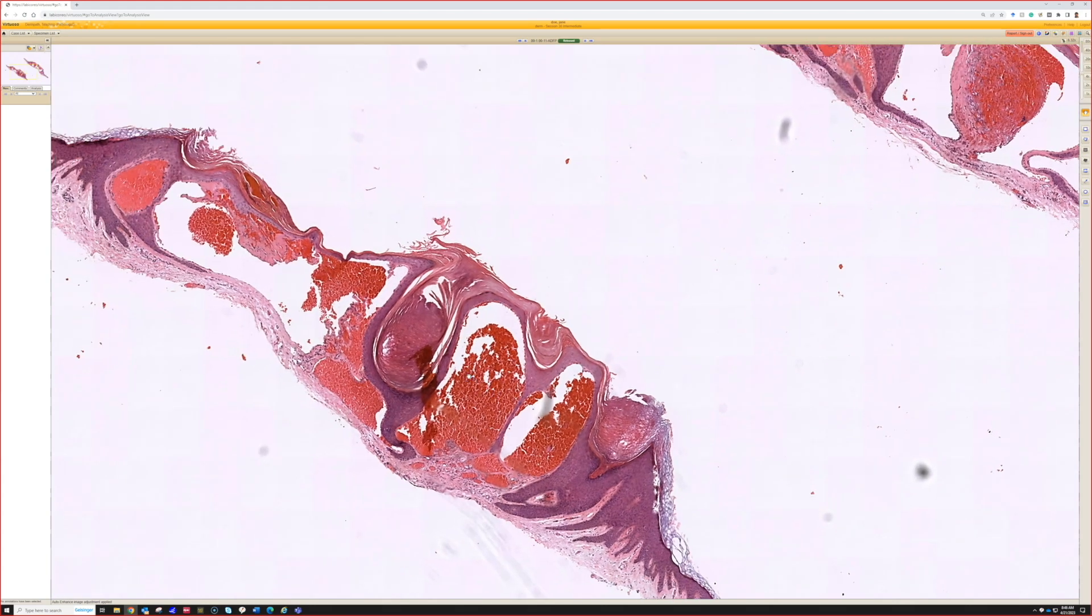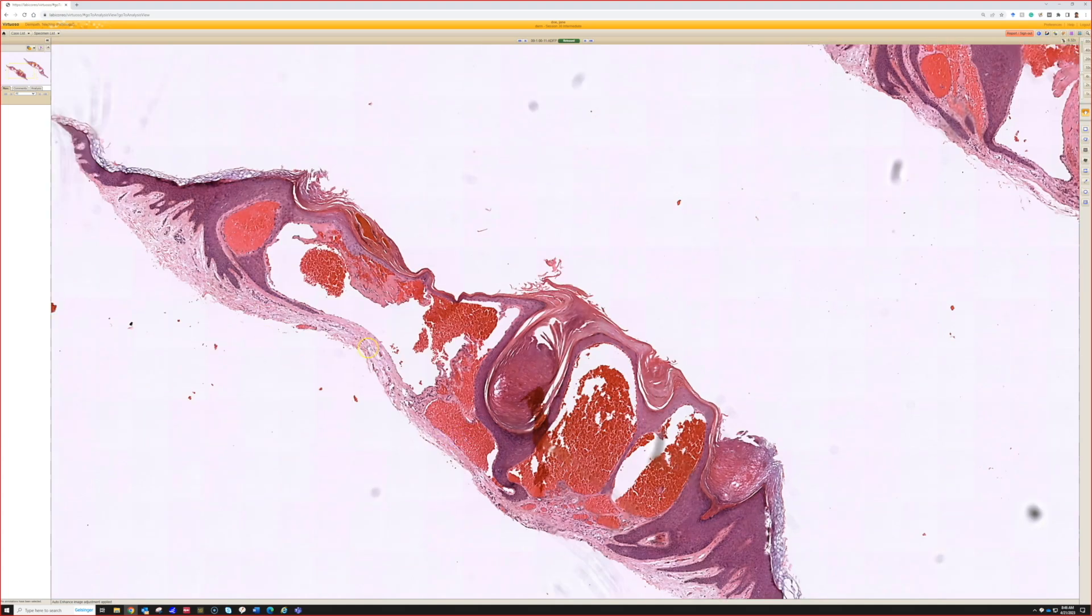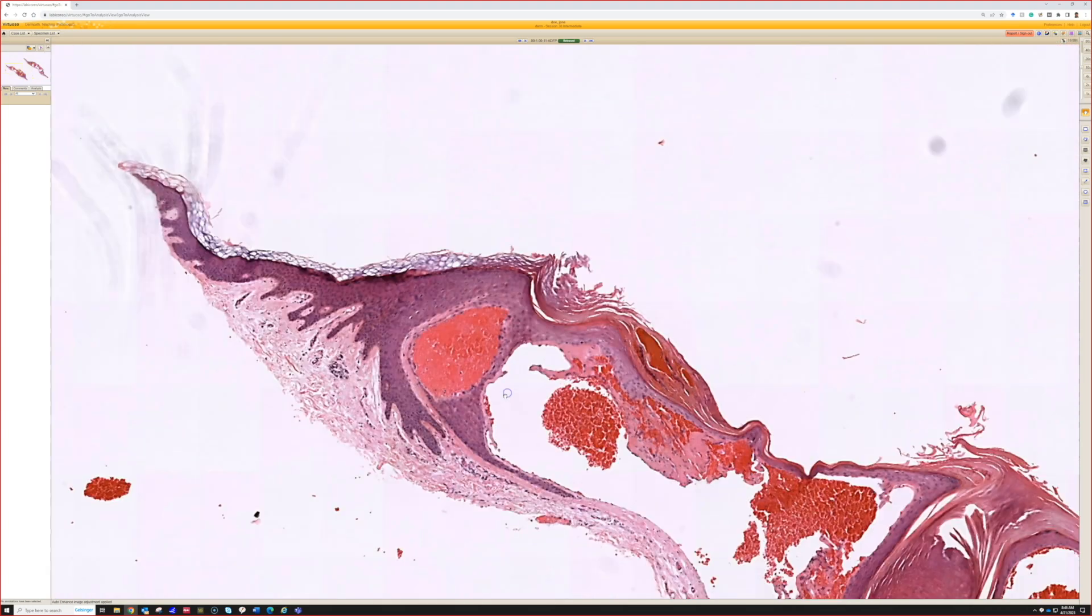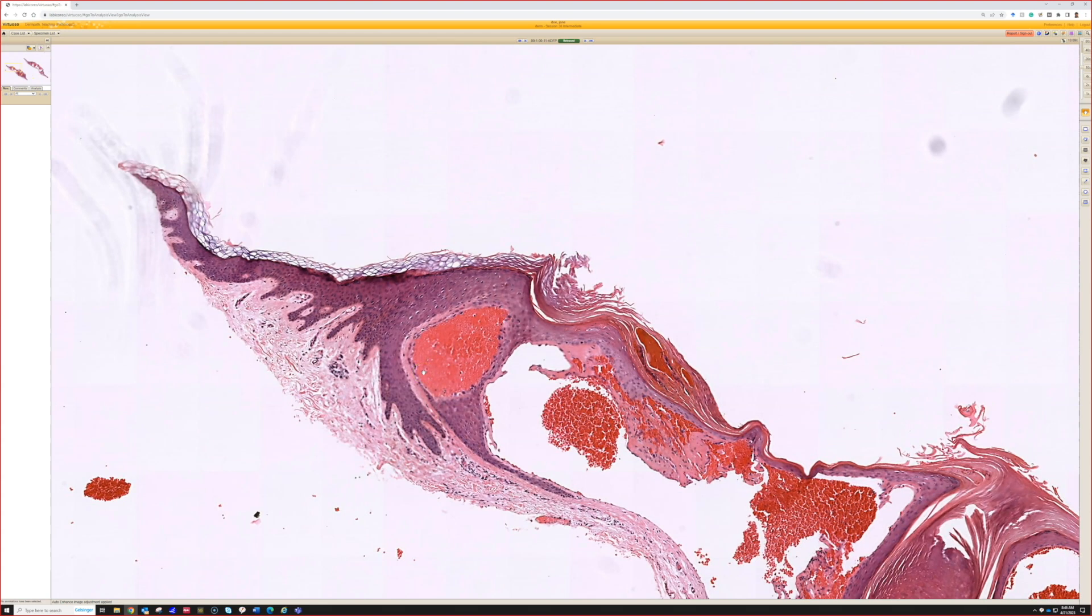Yeah, very nice. This is a beautiful angiokeratoma, and like you said, the channels themselves look quite similar to those dilated cavernous channels that we see at the top of the targetoid hemociderotic hemangioma. The main difference here is that we're actually getting the channels get trapped up and wrapped by the rete of the epidermis.